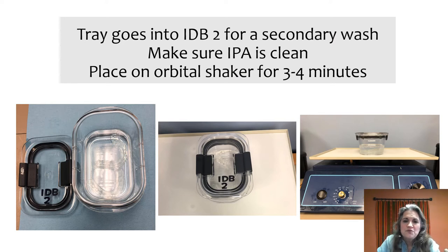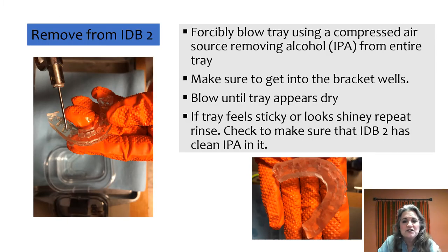Once you've blown it dry the first time, place it into IDB2 — make sure this IPA is clean and uncontaminated. Put it back on the orbital shaker for three to four minutes, then take it off and blow it again. This time, look at the tray — if it feels sticky or looks shiny, particularly down in the wells, put it back and repeat the agitation. You may have extra resin still sitting in those wells. If you start curing with resin still there, you'll end up with an inaccurate bracket well.